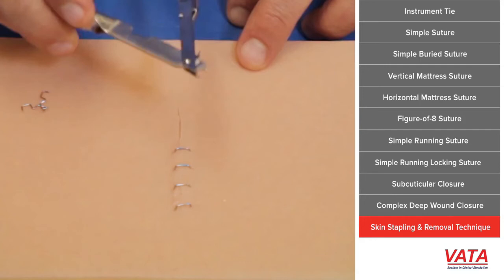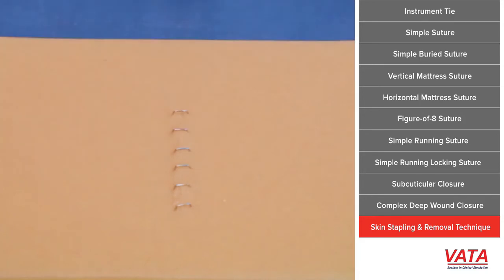I would prefer this method any time of the day, because the tissue here is minimally handled as compared to the second one. See? Yeah. This can be done rather well with patients without even need for sedation, just proper restraint.